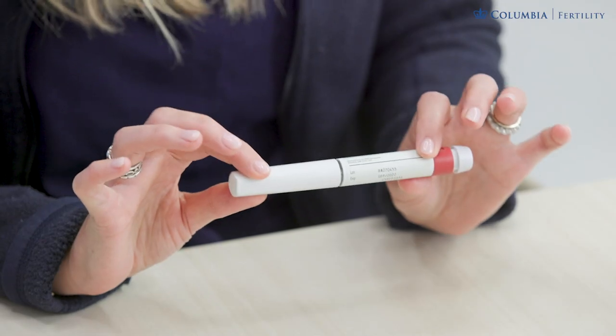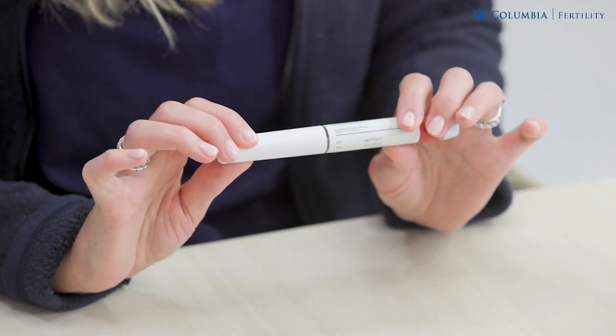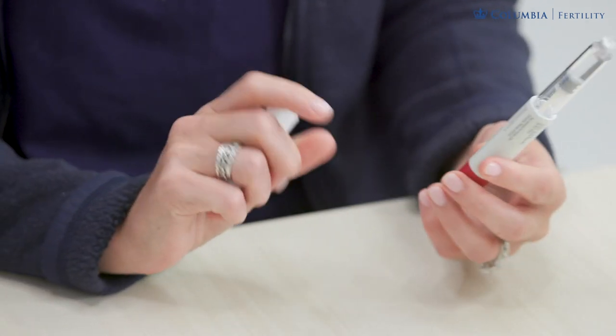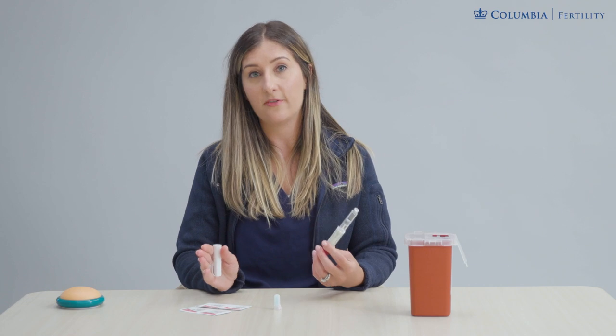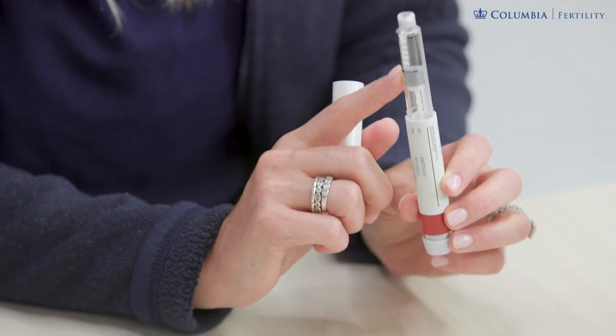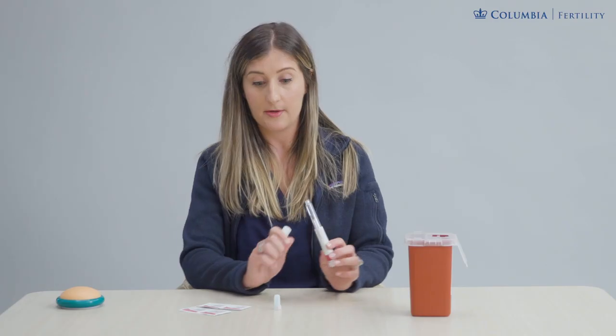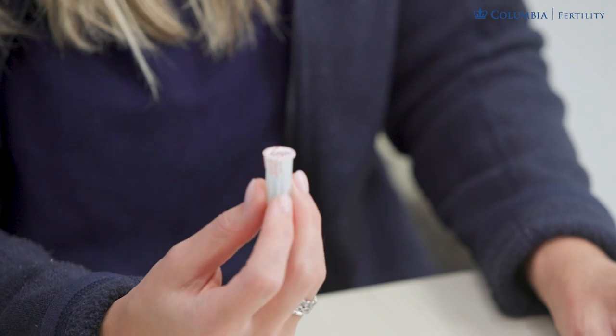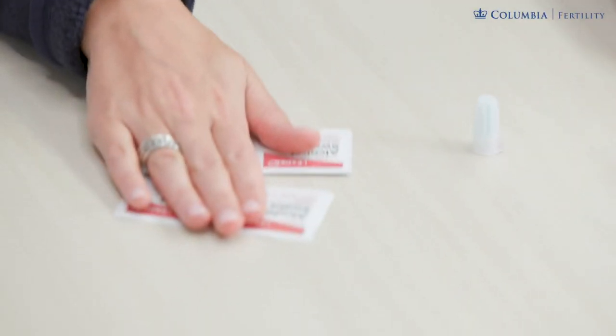Your Gonal F pen, if kept in the fridge, you can remove it about 15 to 30 minutes prior so it's not icy cold when injecting, but it is safe to inject cold if you prefer or you're short on time. Make sure the pen is filled with medicine and that it's clear and not cloudy. You'll also need one of your single-use needle capsules and a few alcohol swabs.